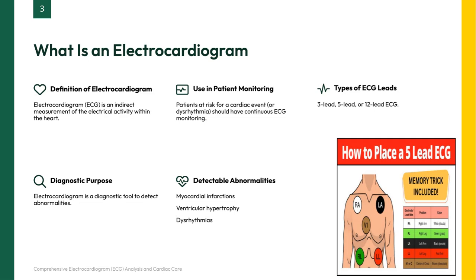An electrocardiogram, or ECG, is essentially a way to indirectly measure the electrical activity happening inside the heart. This electrical activity is what controls the heartbeat, so by tracking it, we get valuable insights into heart function. For patients who are at risk of cardiac events or irregular heart rhythms, continuous ECG monitoring is crucial. It allows healthcare providers to watch the heart's activity in real time and respond quickly if anything abnormal occurs.